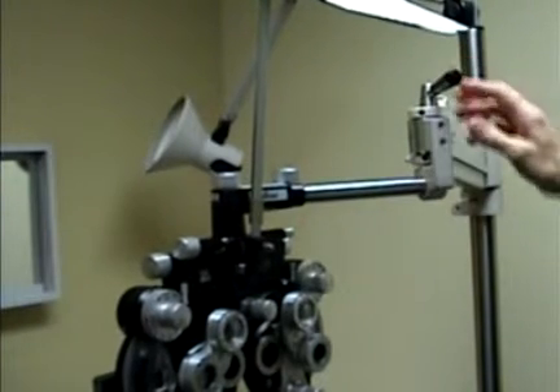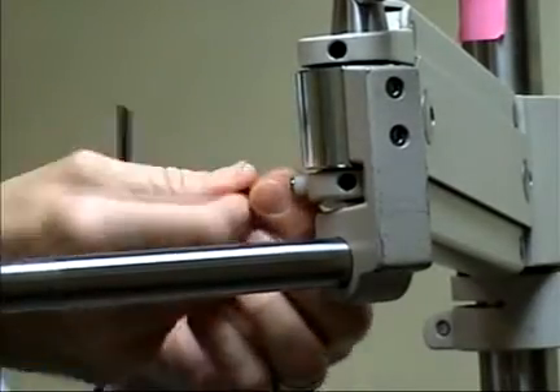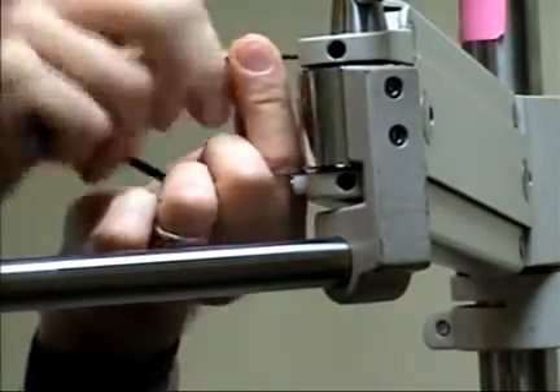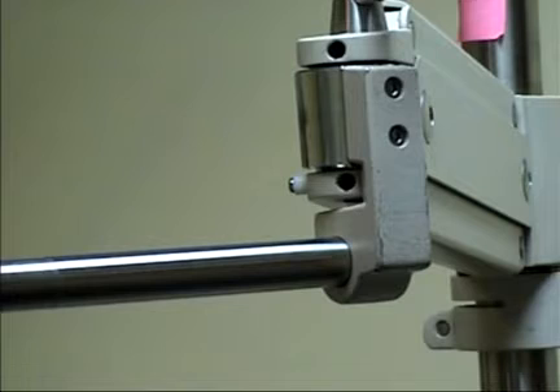So that's a pretty good outcome now. The final step is to tighten the locking screws, and that's a 2-millimeter size Allen screw to lock the adjustment on the phoropter arm.